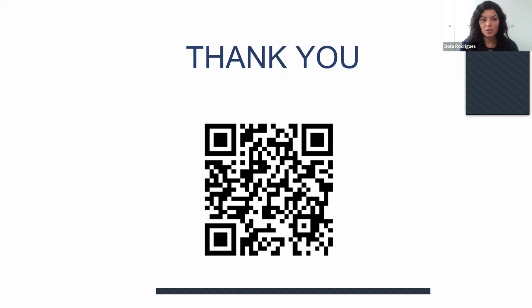So most of my cases are still done in the mouth, but because I have all the technology, I take all the records that I need after that conversion, so I can reproduce everything just like I would have if I did the digital workflow that same day. But for the reline, I'm sorry, I kind of derailed a little from the question, I use Q resin, but again, that is temporary. It might not be the best long term, so I would refer to doctors who use printed dentures long term, or for a longer period of time, for a more accurate answer.